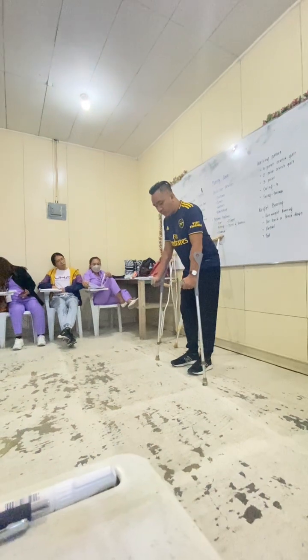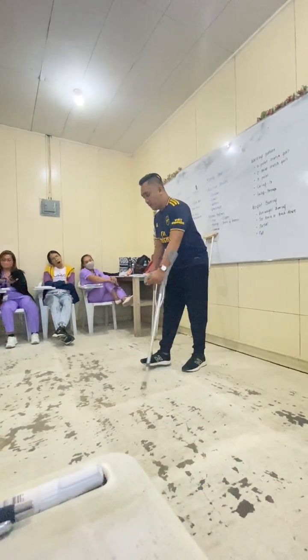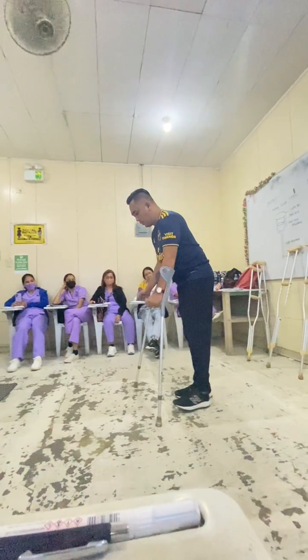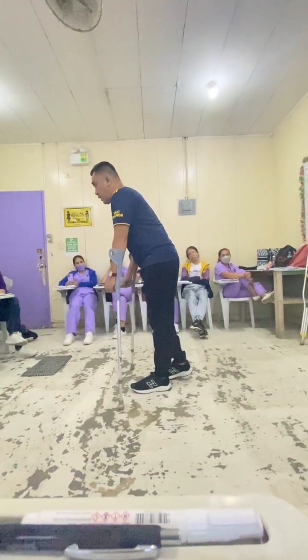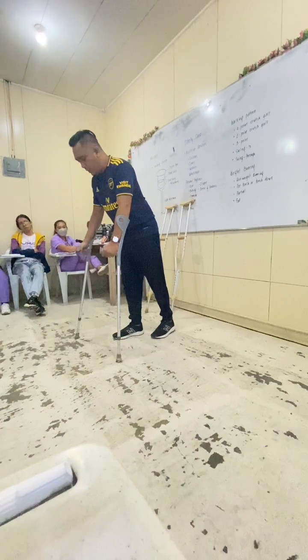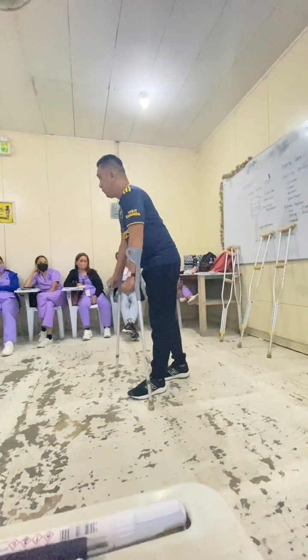So move together your left crutch and your right foot. Okay? And then your right crutch and your left foot. So do it. So 1, 2, 1, 2. Ikaw na maglakaw si patient using the 2-point. But if 4-point na siya, so 1, 2, 3, 4, 1, 2, 3, 4. Use height adjustment.